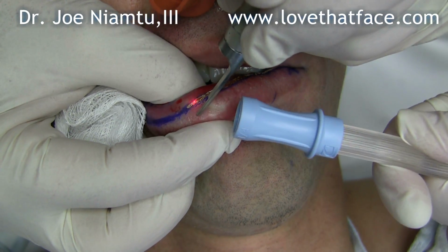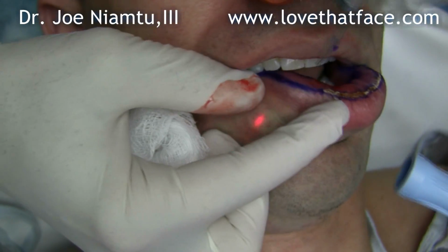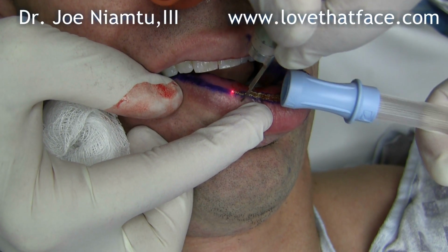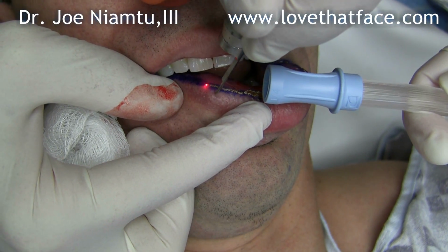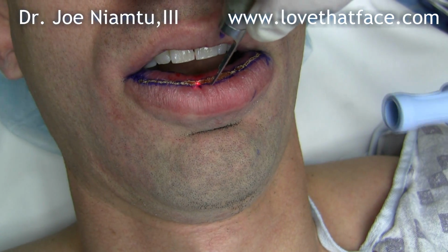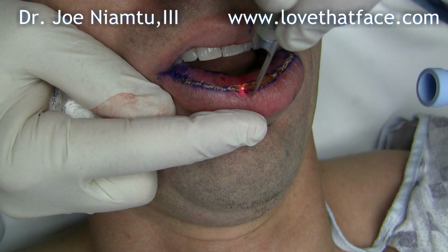And this is really very similar to blepharoplasty. Once we make this incision, we'll remove this ellipse of skin. And everybody knows that the lip is a very vascular structure, and the fact that there's just virtually zero bleeding here.